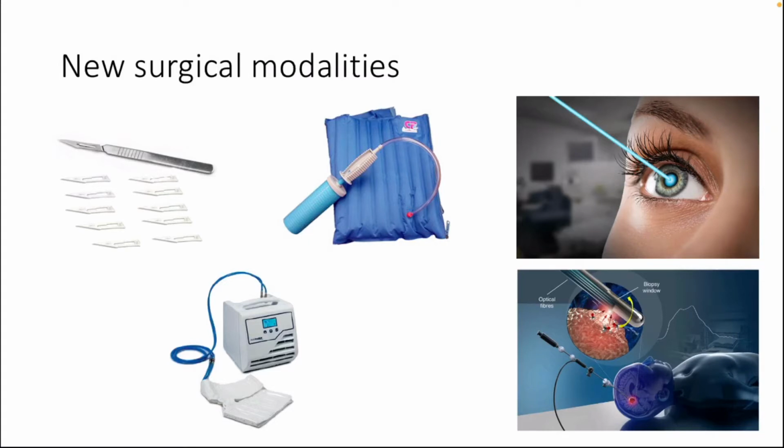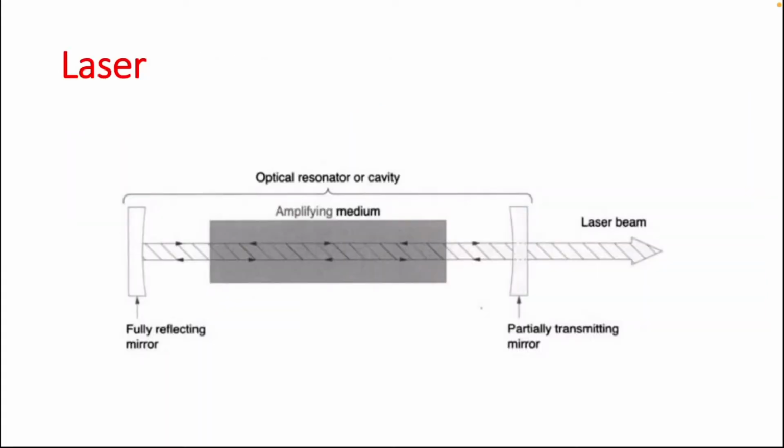In this presentation, we will be focusing specifically on three of the rather modern types of these modalities, which are laser, cryosurgery, and hilotherapy. First one, we'll be taking a look at laser. Laser, which is essentially light amplification by stimulated emission of radiation, is a device that amplifies light and produces a highly directional, high-intensity, coherent and monochromatic beam of light or other electromagnetic radiation by stimulated emission of photons from excited atoms or molecules.